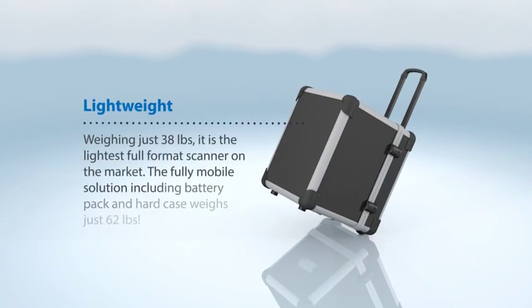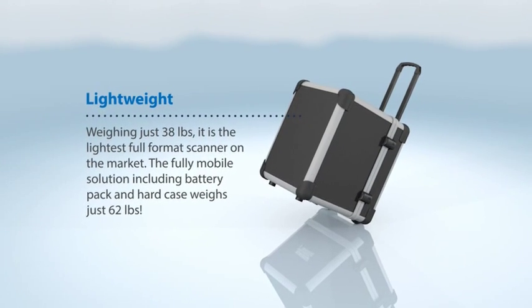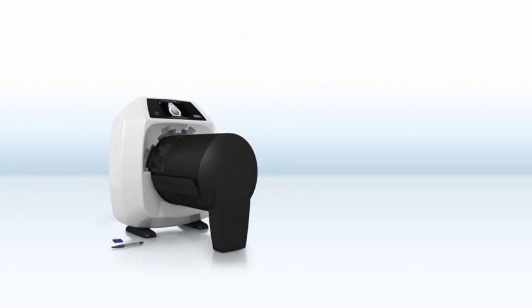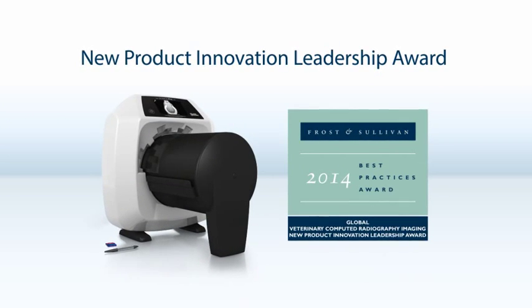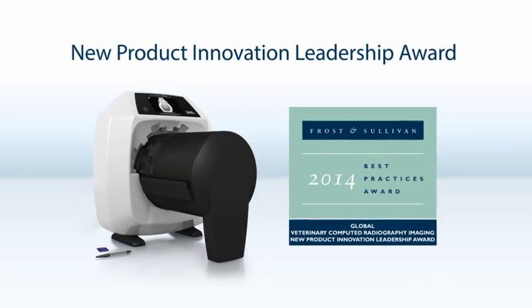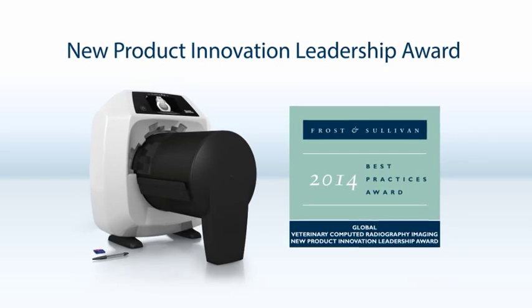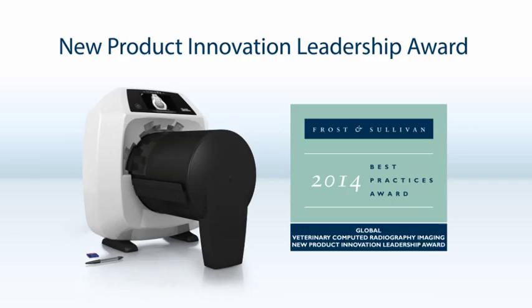The ScanX Pro is easily transported and weighs only 38 pounds. ScanX is a Frost & Sullivan New Product Innovation Leadership Award winner. The worldwide industry analyst noted the ScanX Pro's unique dual focus technology for perfect diagnosable full-body and intraoral images that no other system can match in performance.